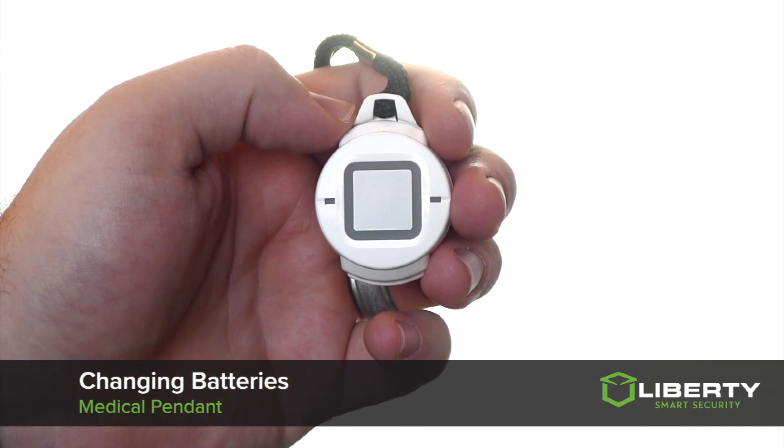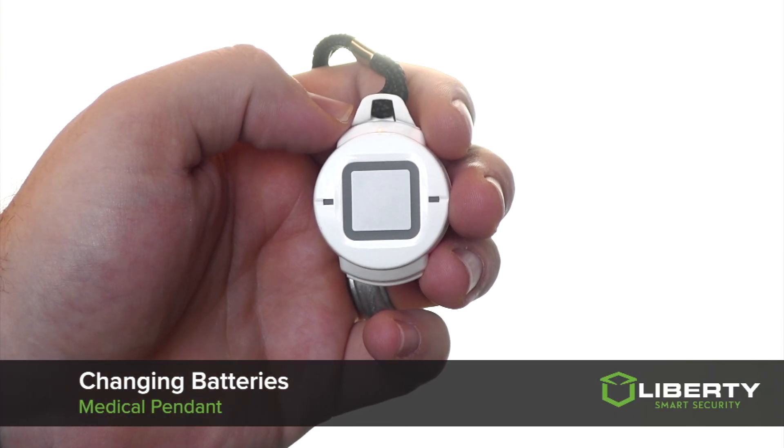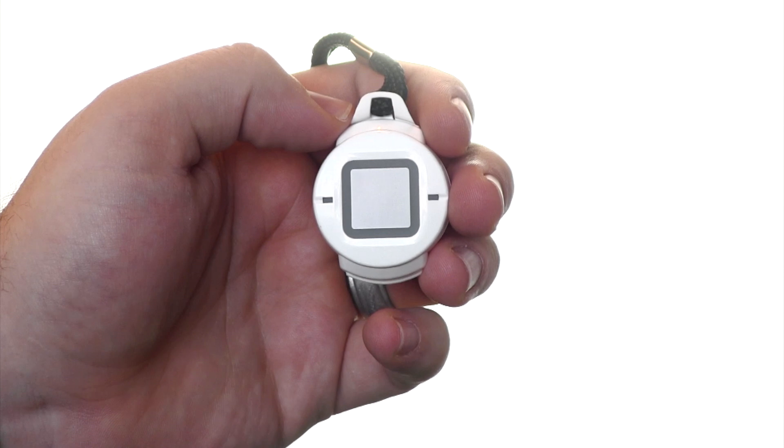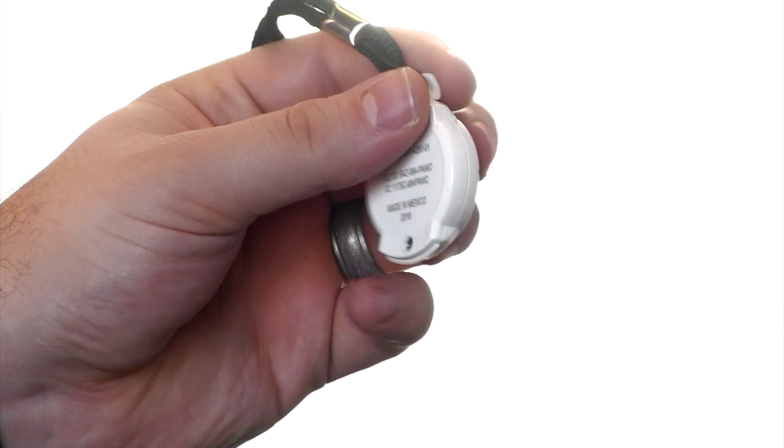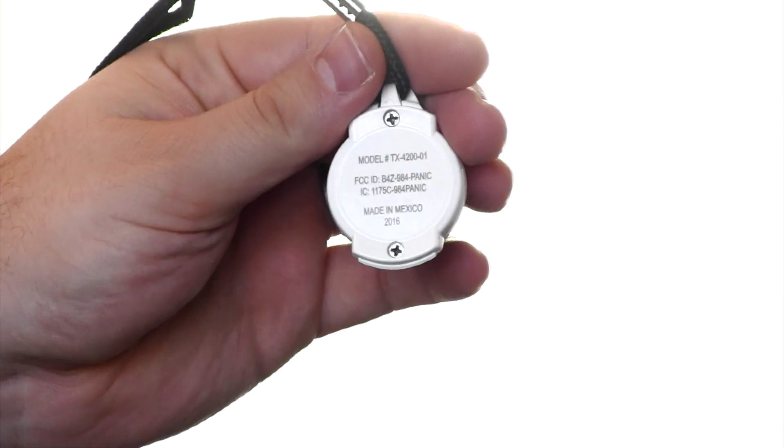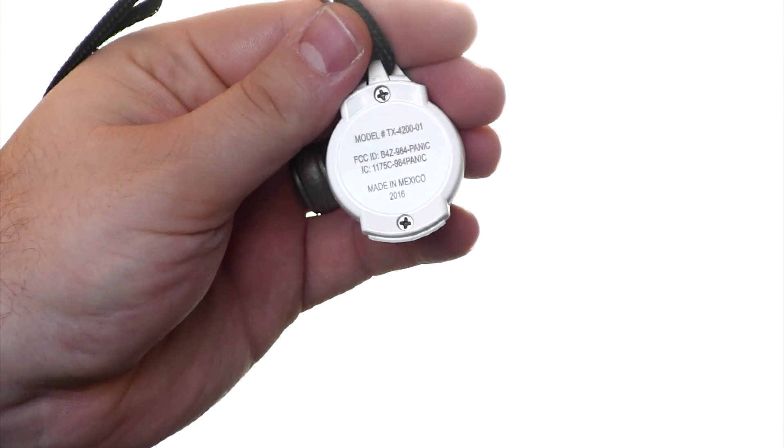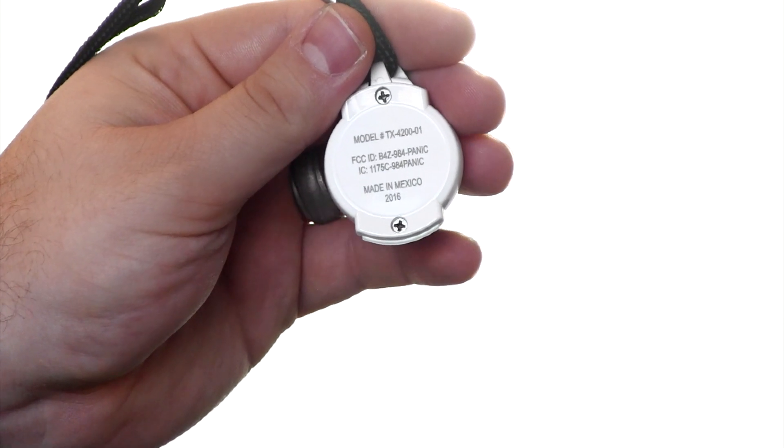The Interlogix medical pendant can have its batteries changed by accessing the screws located on the back of the device. On the backside there will be two small Phillips screws that will need to be removed.